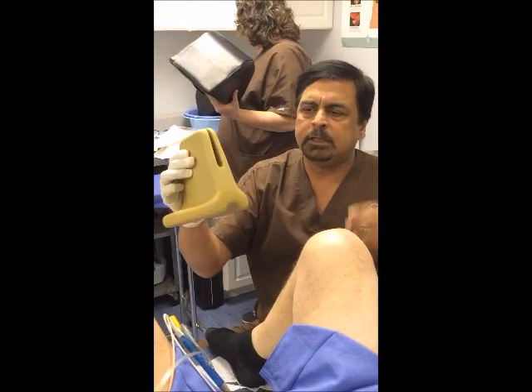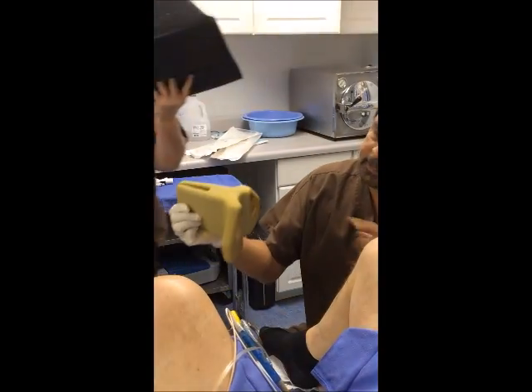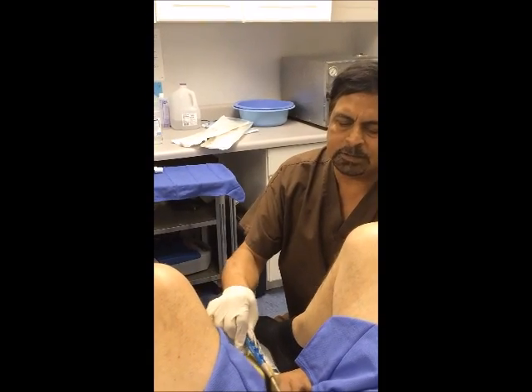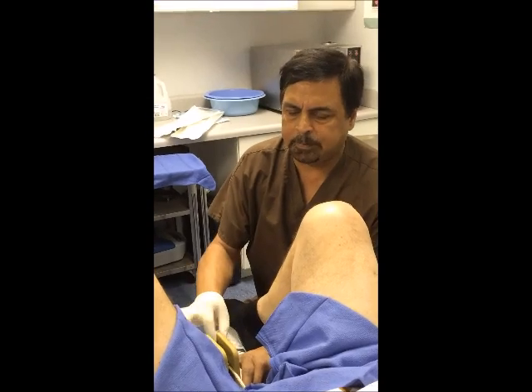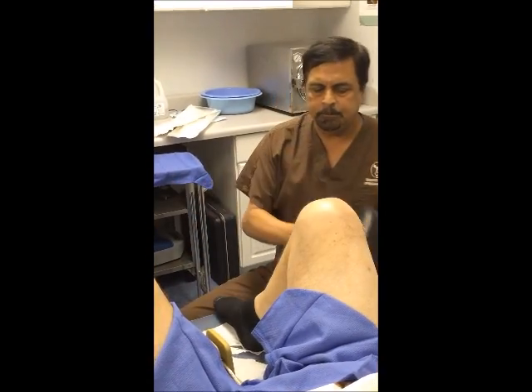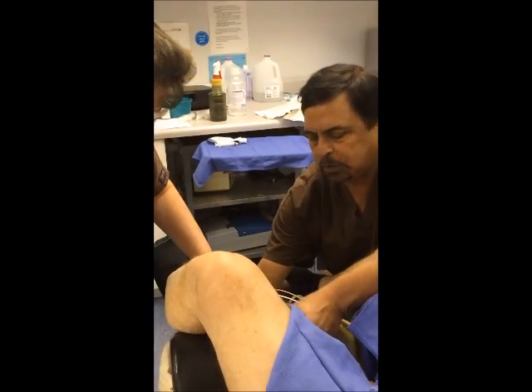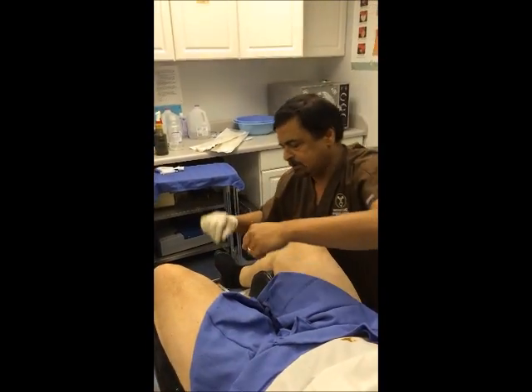We put in a vise — this grips the catheter. It sits on the rectal probe and grips the catheter so the balloon doesn't slide in or out. There have been some problems in the past with the balloon sliding, but this keeps it in place. Then we place the comfort pad so that the patient can have the procedure without any discomfort — he just lies down.